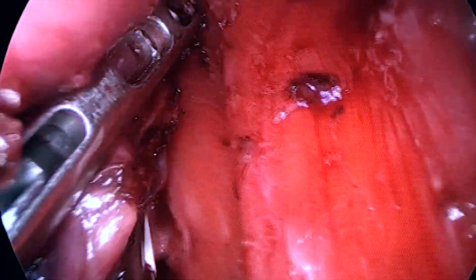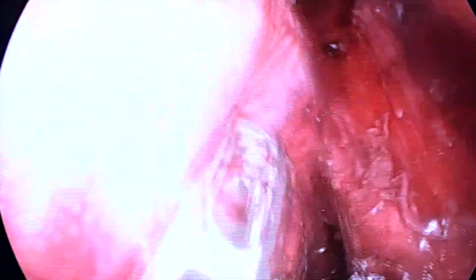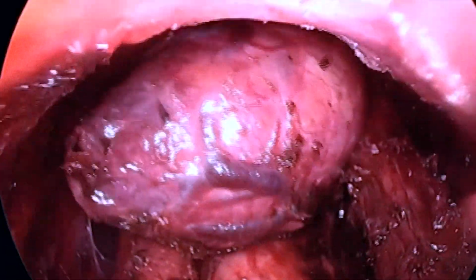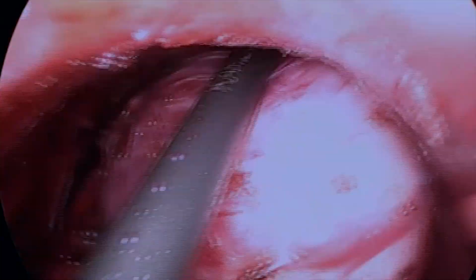Coagulating close to the gland allows preservation of the inferior parathyroid glands. Once the specimen is released, it is placed in a specially designed endo bag to retrieve it transorally.